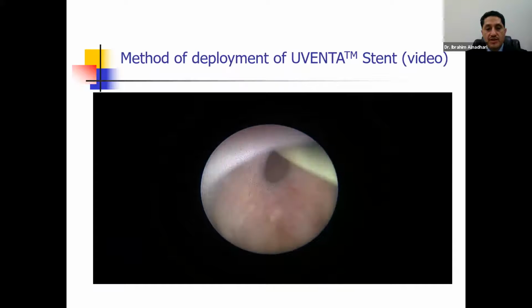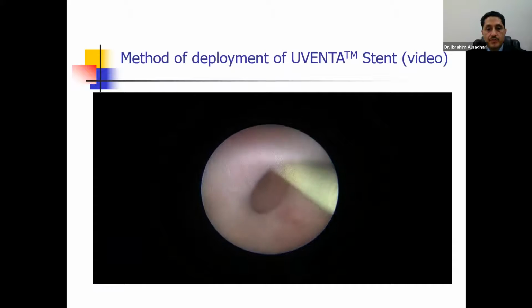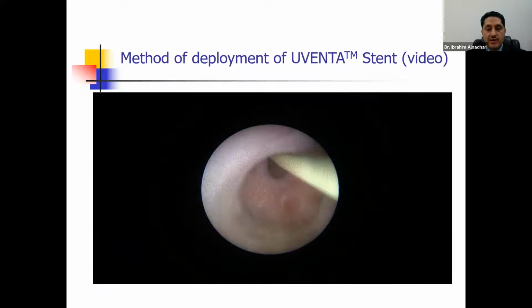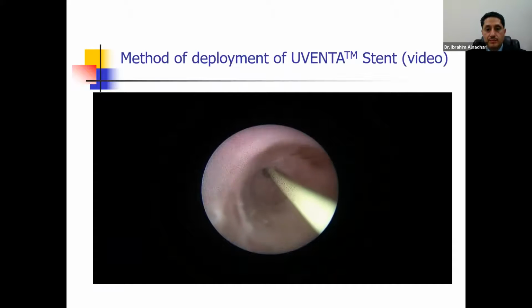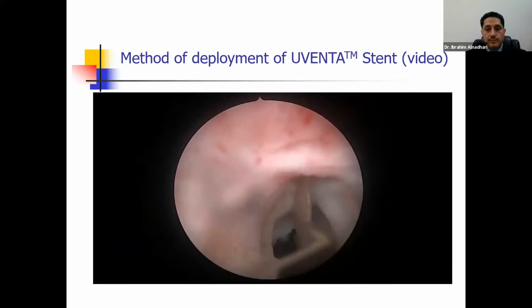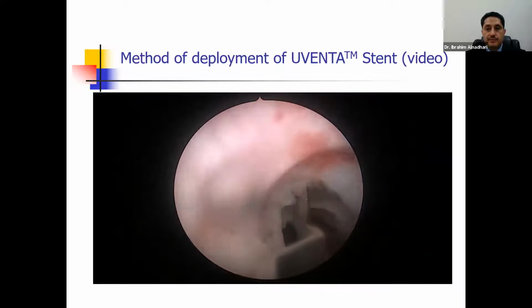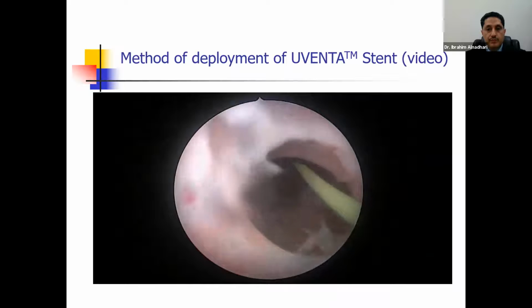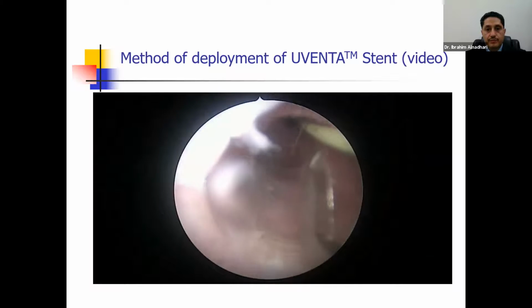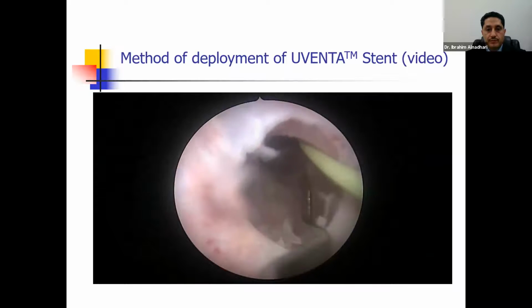Here is the urethrogram, which shows a severe narrow bulbar urethral stricture. This is with the use of cystoscopy. We insert the guide wire. We used to go with a small 6.5 French ureteroscope through the urethra to check the length of the stricture and mainly to check its position regarding the external urethral sphincter. You can see here there are multiple urethral strictures. So DVIU at 12 o'clock is carried out.